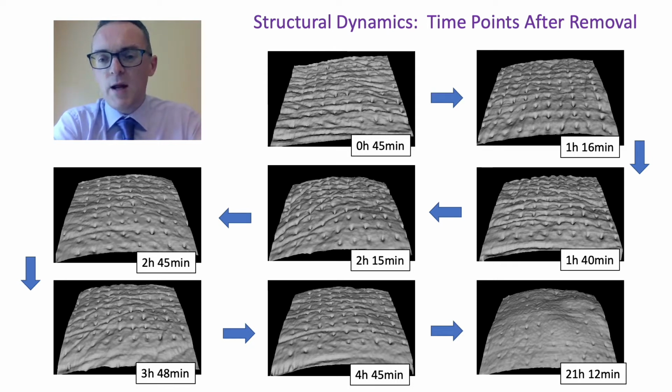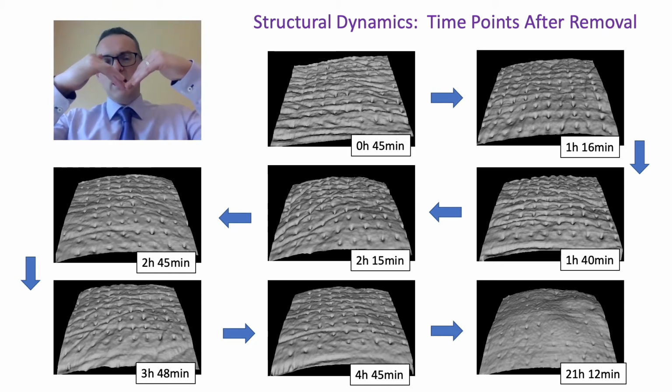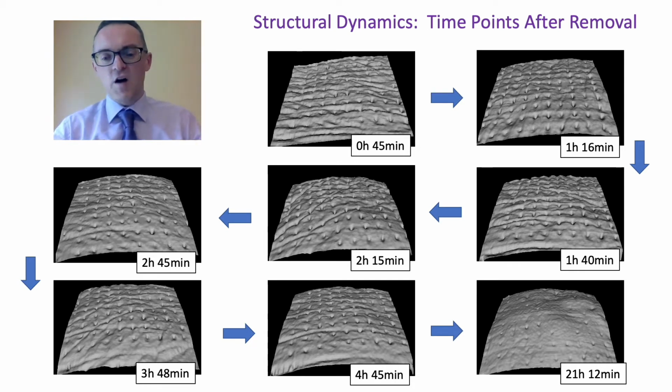What we see in these images are the pores in the skin. The stratum corneum may well have resealed here, but we still have an indentation of the stratum corneum, and that will slowly resolve over time. We can follow that very nicely over a day using optical coherence tomography, where we see that the next day the skin appearance has pretty much returned to normal.